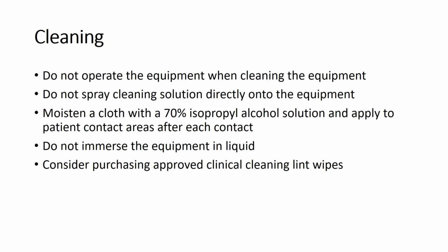Cleaning of the DR plates: do not operate the equipment when cleaning it. Do not spray the cleaning solution directly onto the equipment. If you want to clean the plate, you can use a cloth moistened with 70% isopropyl alcohol solution and apply it to the patient contact area after each contact.